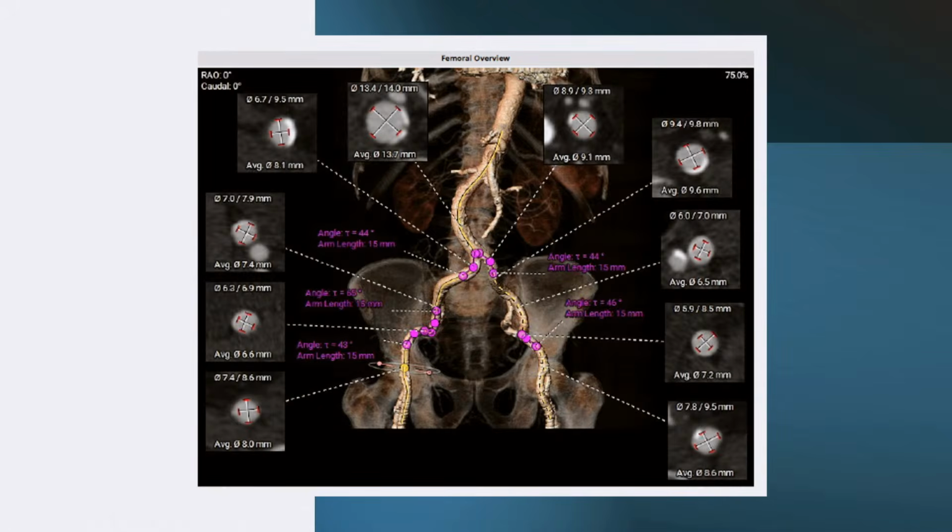But the problem here comes when we are rapidly pacing in such a poor LV, we might encounter some cardiac standstill, and the patient is graft dependent. There is a graft dependent circulation, so whenever we are pacing at this high rate, there might be some drop in the LV function, and the patient might have a cardiac arrest during the procedure. That is one more reason why we have selected a balloon expandable valve, because we'll be pacing for a shorter period and then deploy the valve and come out. So we'll see what difficulties we encountered during the procedure.